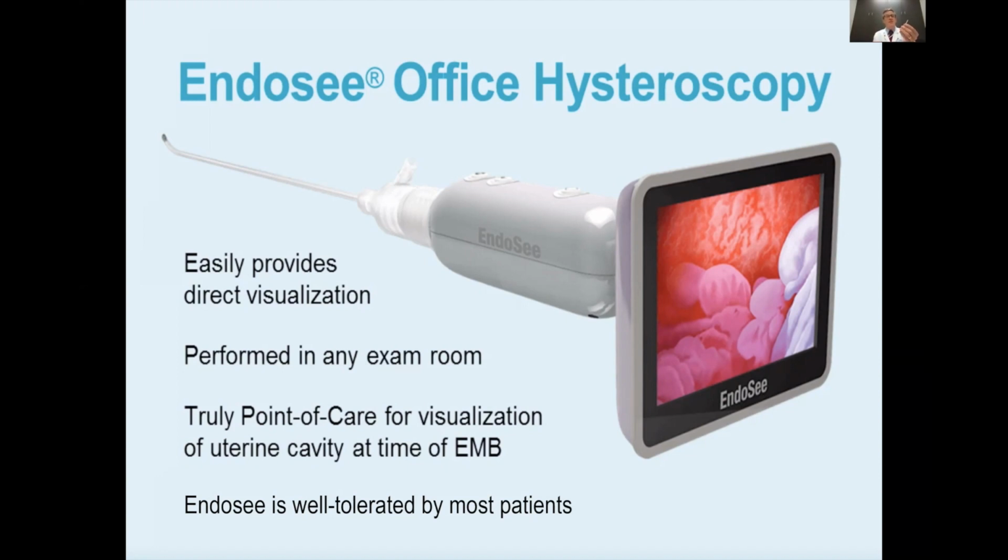At the very end of this device, there's a small camera, which you may or may not be able to appreciate on this video, but this puts a camera directly into the uterus. We have a handpiece, which you see on your screen here, that attaches to the device that provides us an immediate picture of what's going on inside that uterus.